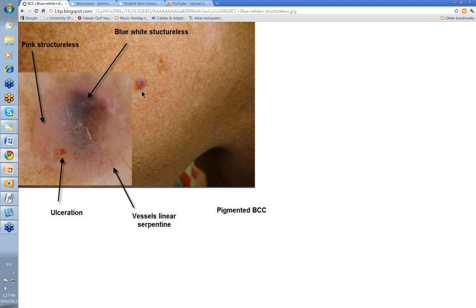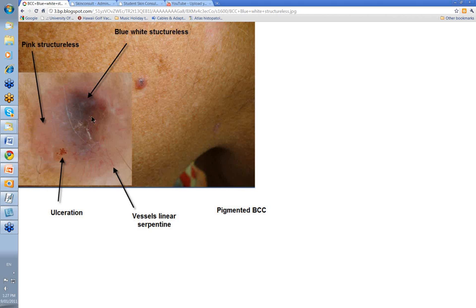Here's another pigmented BCC — pink and some blue. This is a blue area here: blue-white or blue-grey structureless. We've got vessels linear serpentine again, a little bit of ulceration here, and again pink structureless. Wider pink structureless is quite commonly seen in basal cell skin cancer. So this is another pigmented BCC.